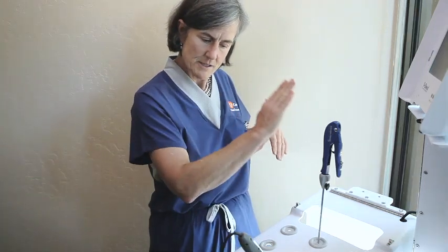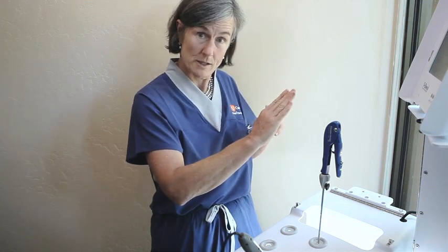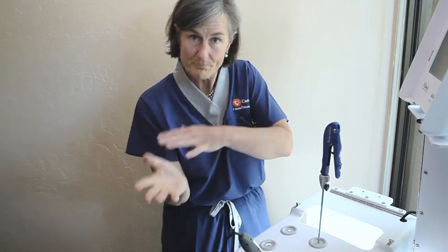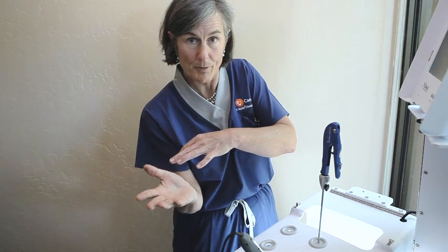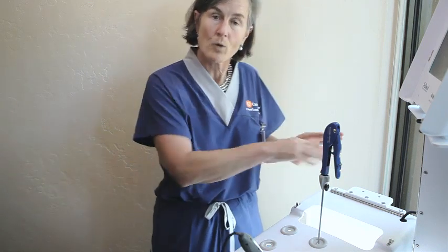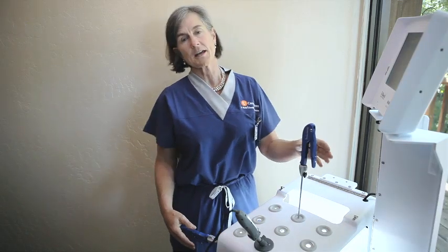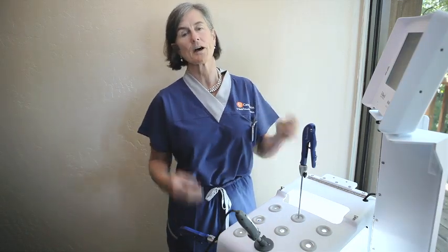My patients are always in steep Trendelenburg at 33 degrees so that all the intestines fall to the upper abdomen and so that I'm working clearly and cleanly in the pelvis. This is the position where I'm standing straight. My elbows are by my side.